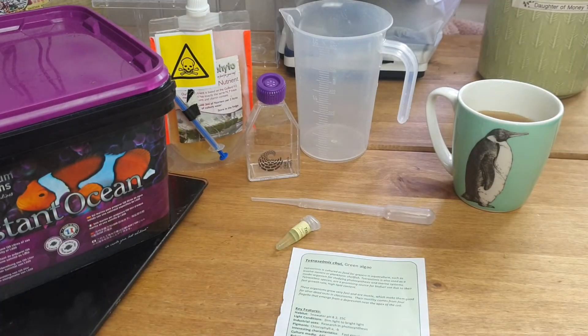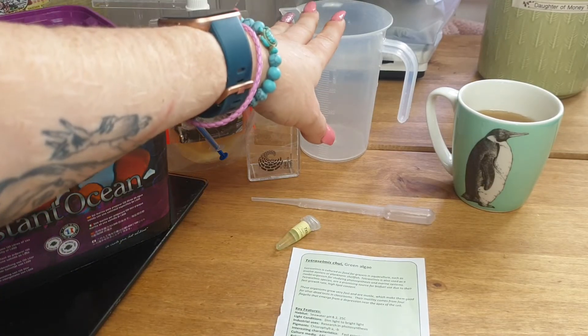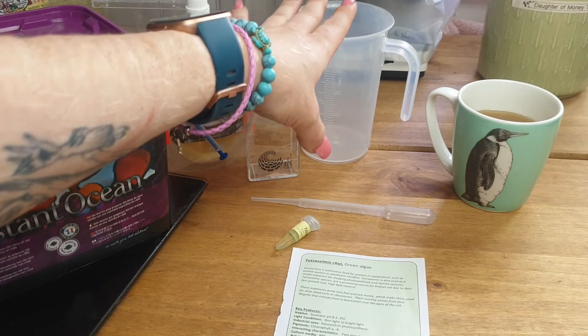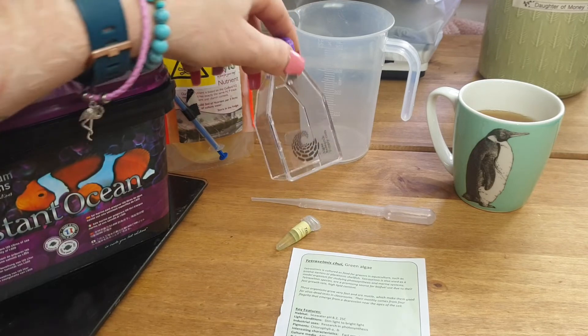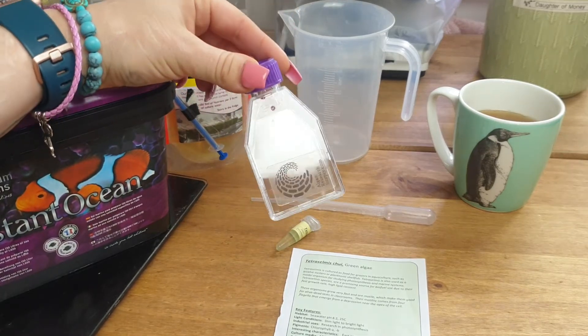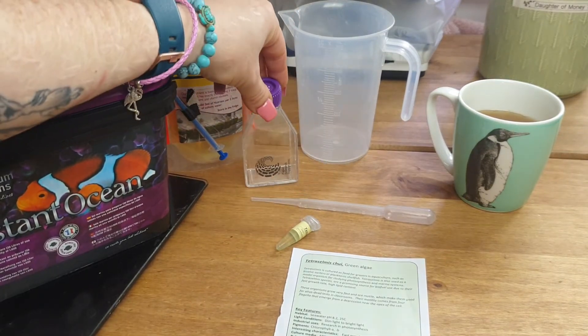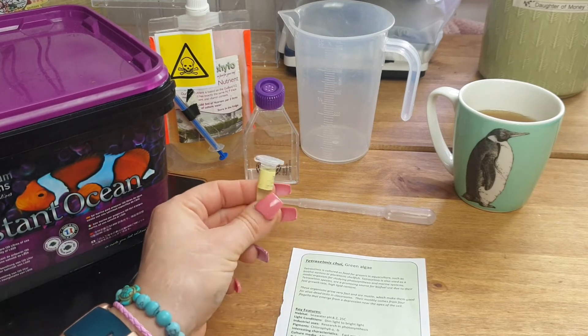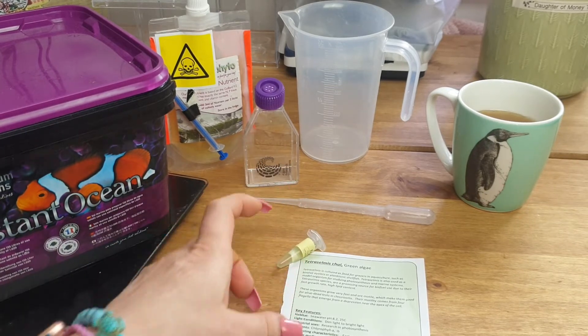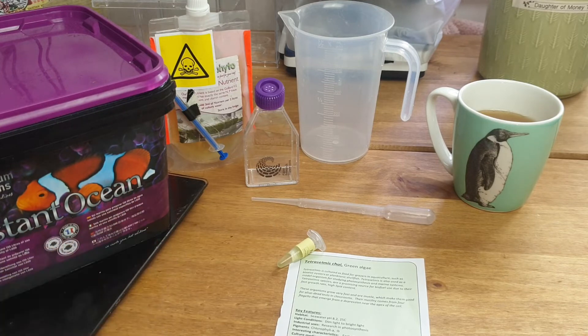The first thing we need to do is make up the culture medium, which I'm going to be doing in this jug because I'm going to be using the same culture medium for four different types of algae. I'm going to make up 500 ml of it — we only need a small amount for the culture jar. It's best to start off with a small culture and then increase by adding more culture medium as you go along, rather than start off with a very large culture from such a small amount of algae.